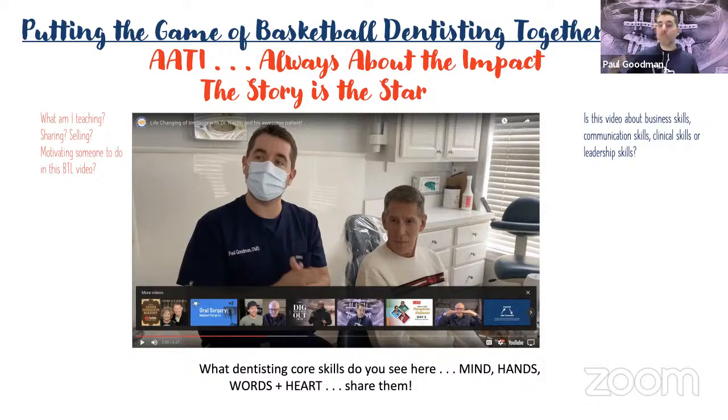Remember, too much bone can be a problem. Taking a 3D x-ray, don't give anyone any sort of long-term plan without seeing the 3D x-ray. You can talk about fixed or removable, but don't say, oh, you definitely could do fixed before you see the CBCT and you realize they have paper thin bone that's way too thin and it's not practical. It doesn't mean you couldn't build up the bone, but make sure that you're talking in broad brushstrokes to help the patient understand what fits best into their life at this time.